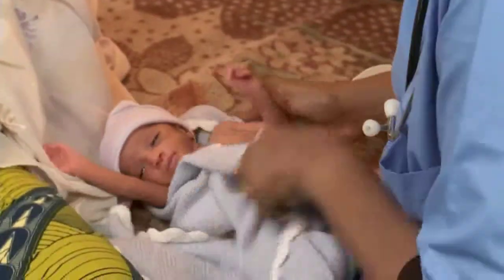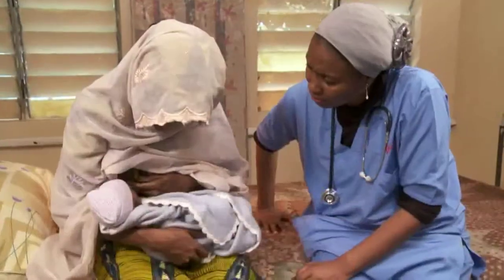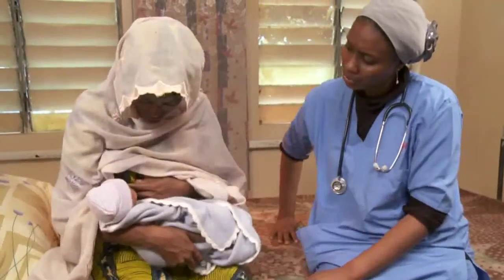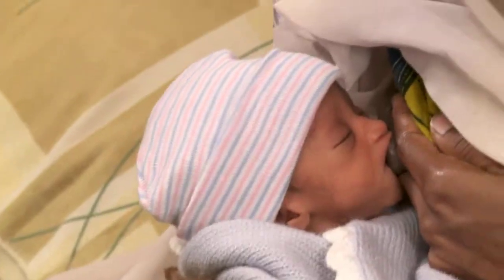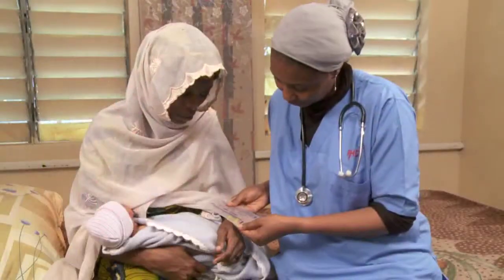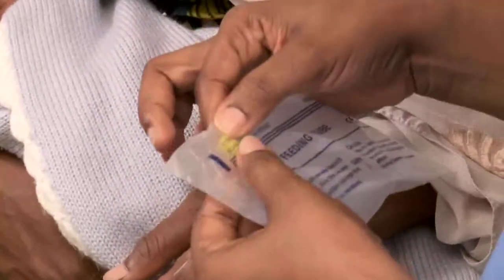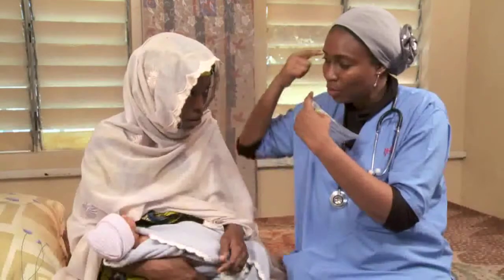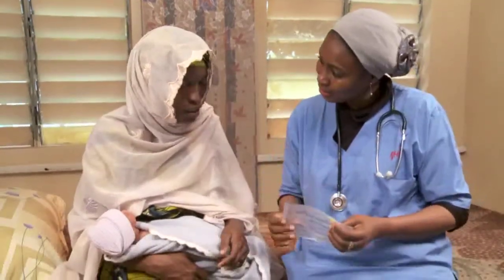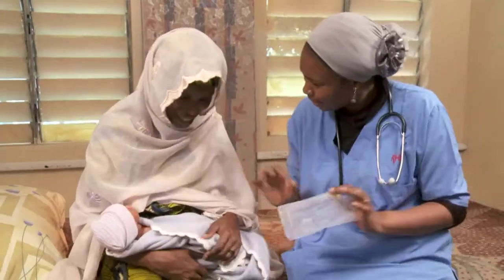This small baby was born too early. He's not yet able to breast or cup feed effectively. A gastric tube is needed until he's grown enough to suck and swallow on his own. Take the time to talk with the mother about the procedure and the need for it. Reassure her that this is safe and will not hurt the baby.